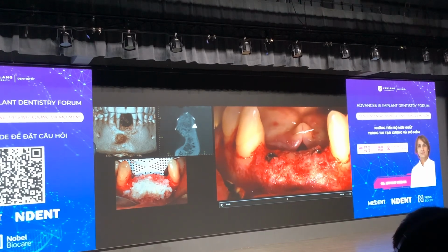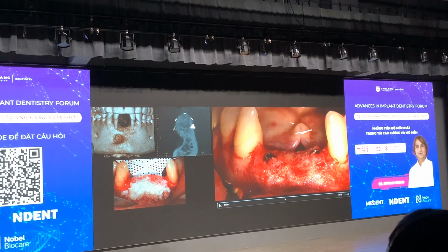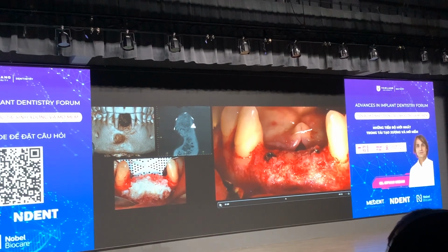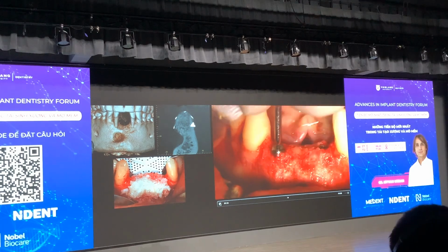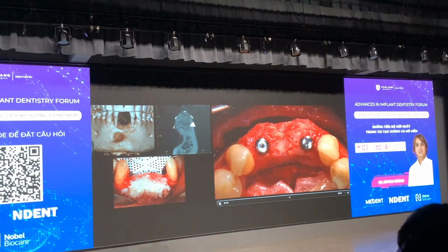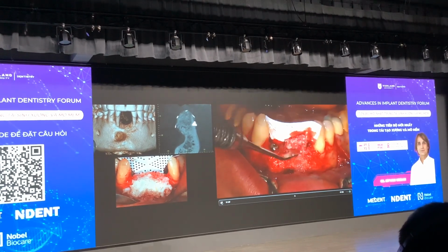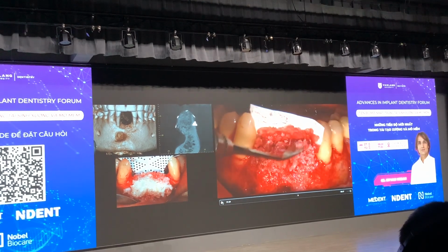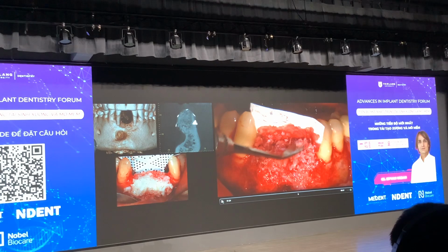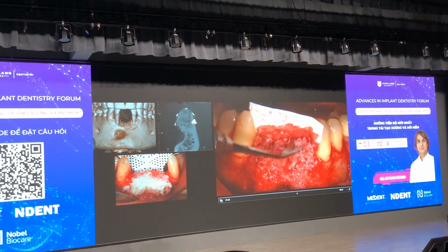Good. Now, what do I have to do to prevent the bone loss? Mini sausage. Okay? Either deeper or mini sausage. Let's do mini sausage. Okay? What does the mini sausage consist of? It consists of about 70 to 80% of the xenogenic bone graft, and some autogenous chips.